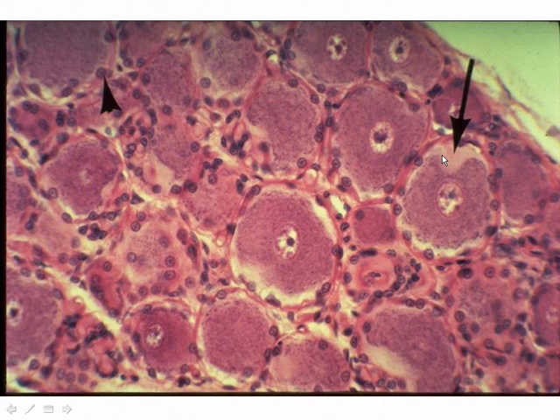And what you will note is here in this one particular area, that's an area that is free of this Nissl substance. That is because this is the beginning of the axon. It's kind of a staging area for those molecules and organelles that will be sent down the axon.